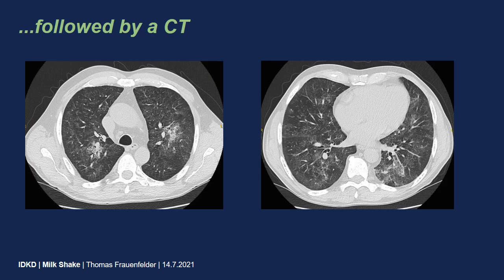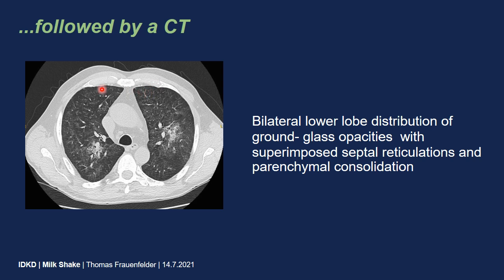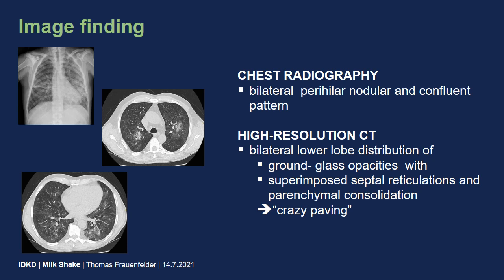Afterwards, a CT was performed that showed bilateral, more lower lobe distributed ground glass opacities with some consolidation and some reticulation and septal thickenings. In summary, we have a chest radiograph showing bilateral perihilar nodular and confluent pattern with ground glass opacities, and on the HRCT we have a bilateral lower lobe distribution of ground glass opacities with superimposed reticulation and parenchymal consolidation, which is also well known as crazy paving.